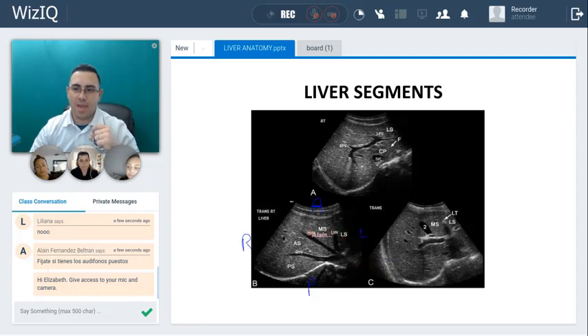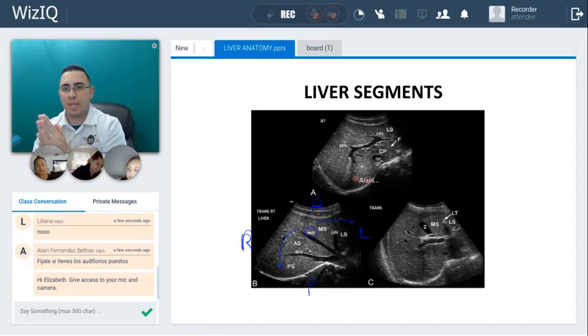This one is the middle hepatic vein, and this middle hepatic vein is going to divide the liver this way into the right lobe and this way into the left lobe. Does it make sense? This is the right part, this is the left part. Don't forget: the middle hepatic vein divides the liver into left lobe and right lobe.